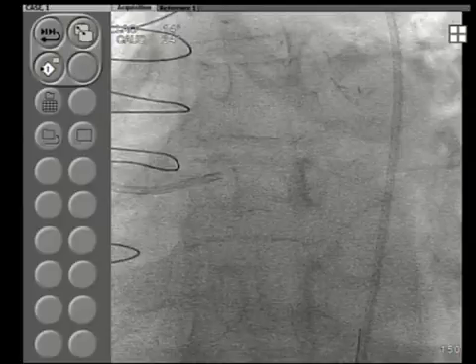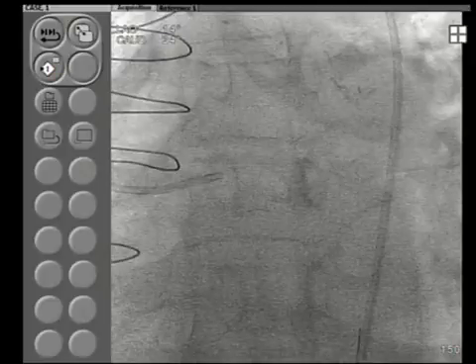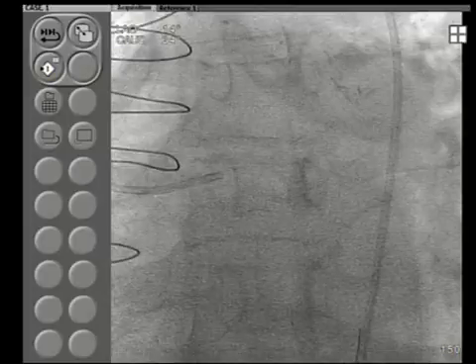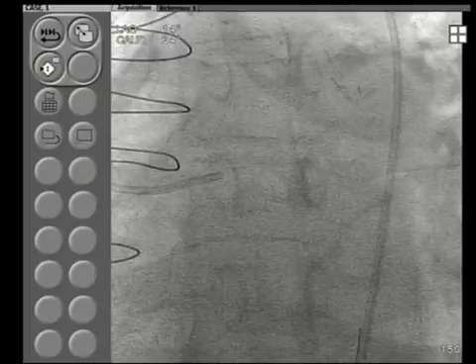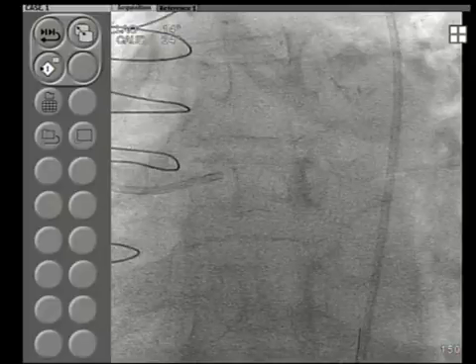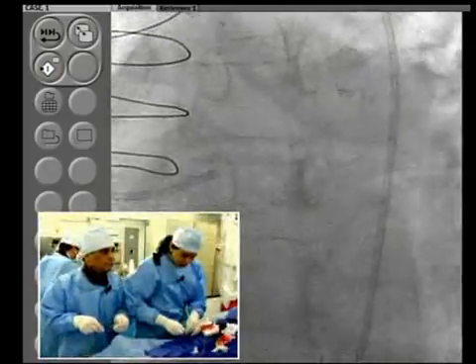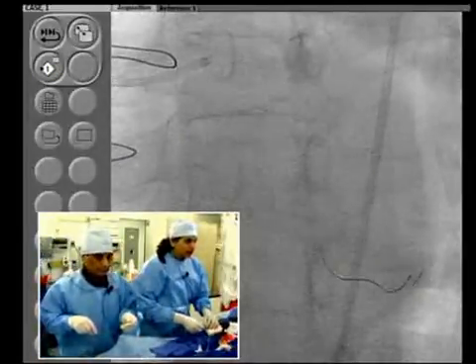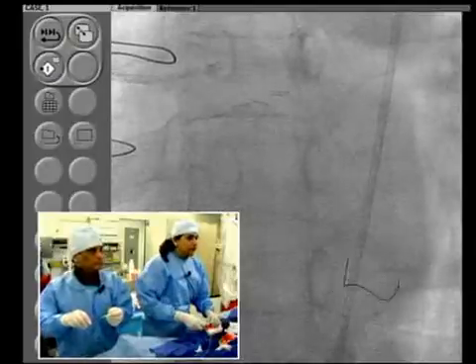It's okay. The question is that now, do we stabilize the left main and the proximal circ before going into the CTO? Well, if we put a stent in the left main, look at that angle, we might have a lot of difficulties in negotiating any further stent down in the OM. The good thing about the over the wire Venture system is that if at all you need to change the wire, it will be much easier. If Fielder was not working, the next wire that we would have wanted was Whisper.